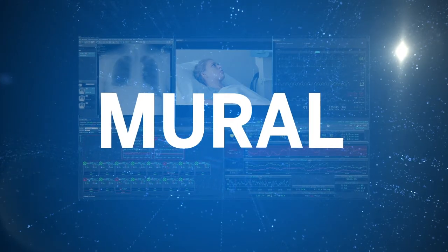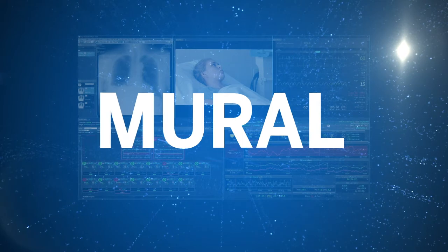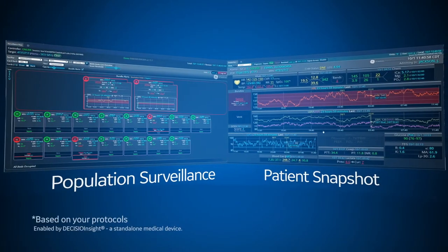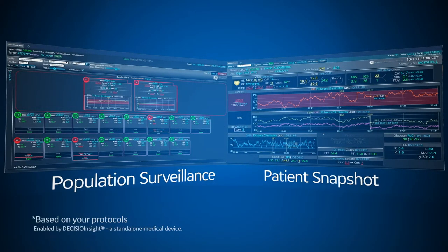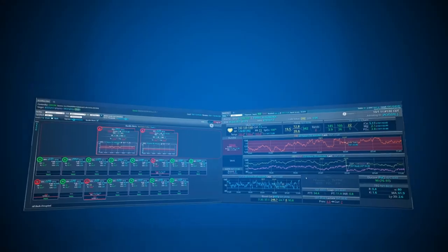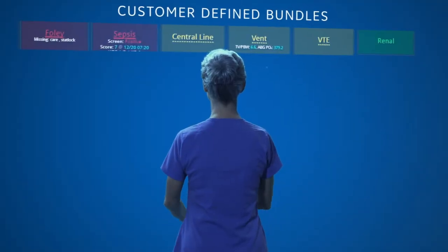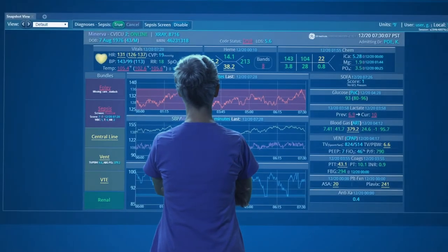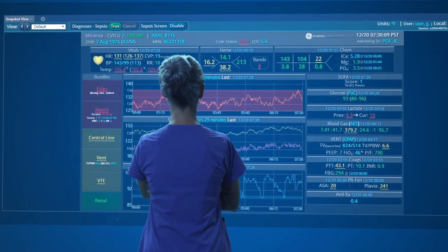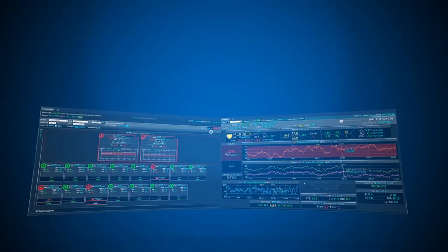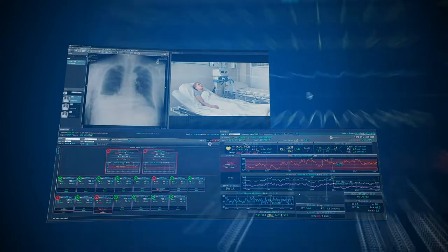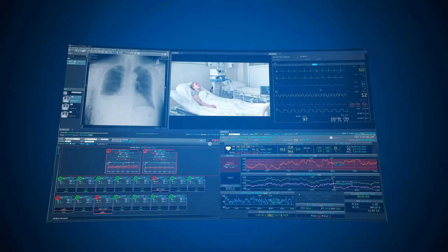Clinical decision support that can be customized to your clinical standards. At the heart of the Mural Solution are population surveillance and patient snapshot views that help identify patients at risk and highlight the most relevant patient data. Imagine clinical decision support based on protocols defined by your hospital, integrated within the Mural offering to minimize care variation. The Mural Solution can expand with additional standalone applications, synchronized in a single pane of glass.